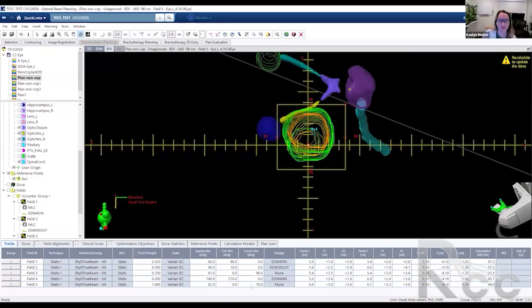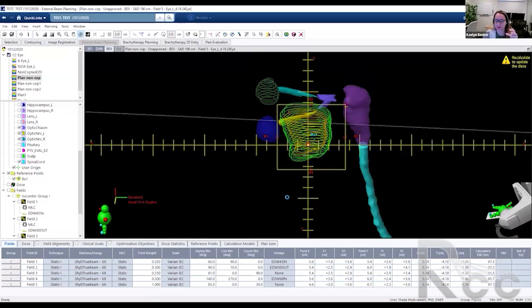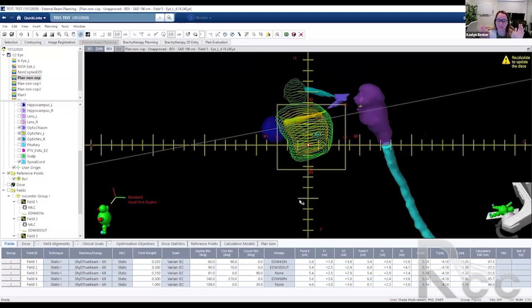So now Shada, we have a quick question. Sure. People are wondering, when you're making your field, I had a couple questions asking about how you set the boundaries, wondering why there's more space around the PTV and why it's not close to the edges.